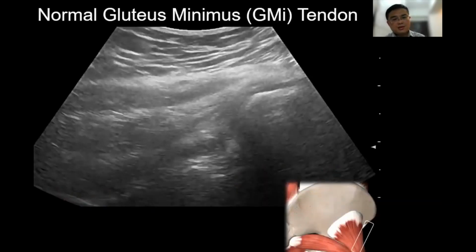So a less common but possible diagnosis of the anterior lateral hip pain will be a problem of the gluteus minimus tendon. So as you can see, the gluteus minimus is located underneath the gluteus medius, and the attachment is under the anterior facet of the greater trochanter.